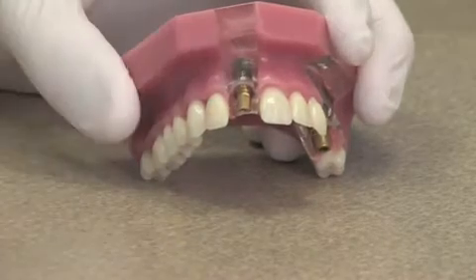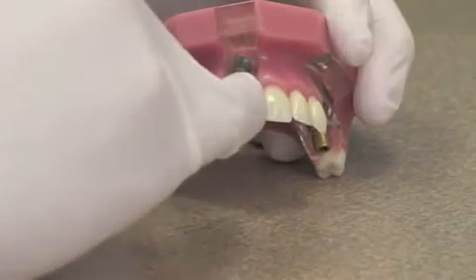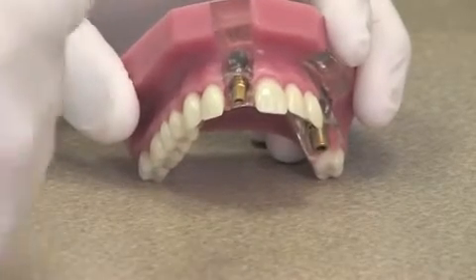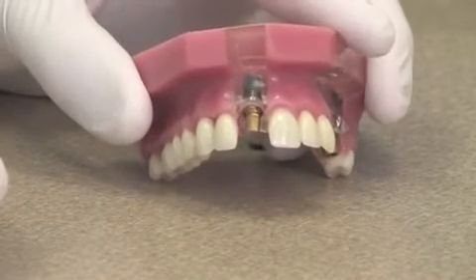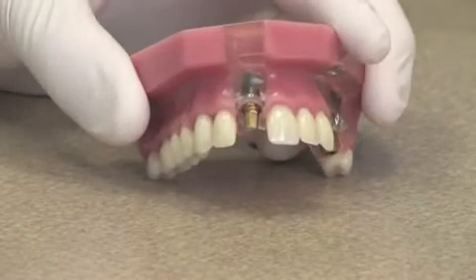When the bone has had a chance to grow around that implant and it is locked in there tight, another piece is attached to the implant. This piece is called an abutment. The abutment is then attached to the implant, and then a crown is made to fit over the abutment. So really there are three components: there's the implant, the abutment, and then the crown that fits over it.